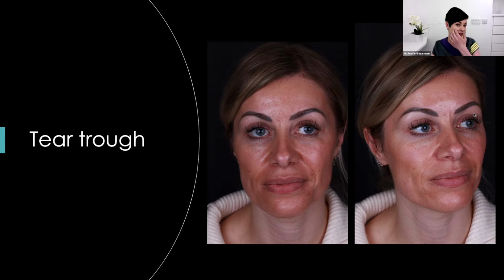So this is our first case for today. You might think she doesn't look too bad, but if you look closely, you can see the puffiness under her eyes. She presented with bilateral infraorbital swellings, which have been there since she had tear trough filler 18 months ago. They're not painful, they don't fluctuate, but they're unaesthetic.